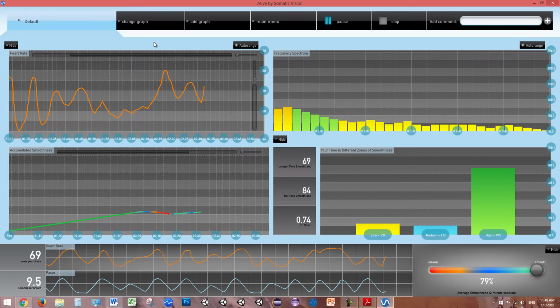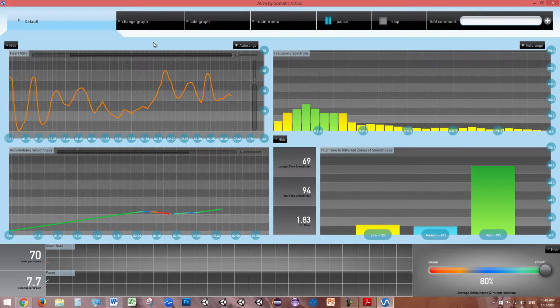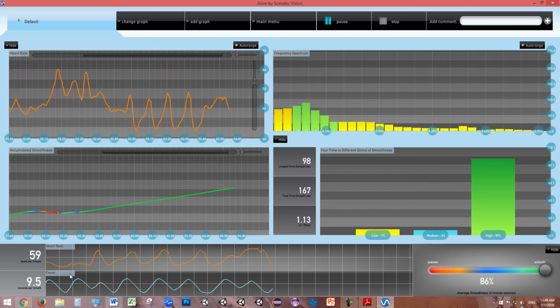If your heart rate goes through one complete up and down wave in 10 seconds, this is a 0.1 Hz wave. You can see the resulting increase in the 0.1 Hz bar in the spectrum graph. To help pace your breathing, you can use the light blue breath pacer in the bottom graph area.